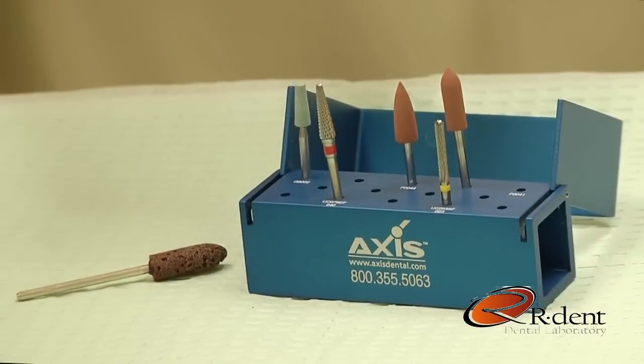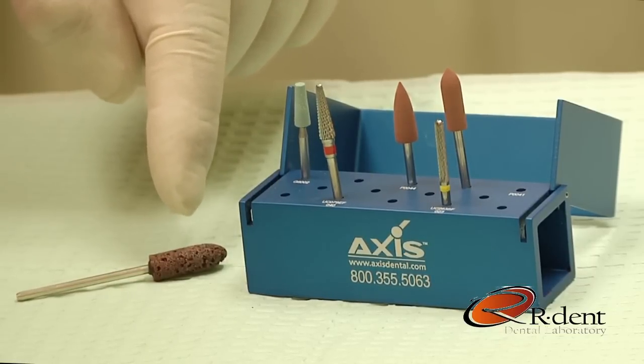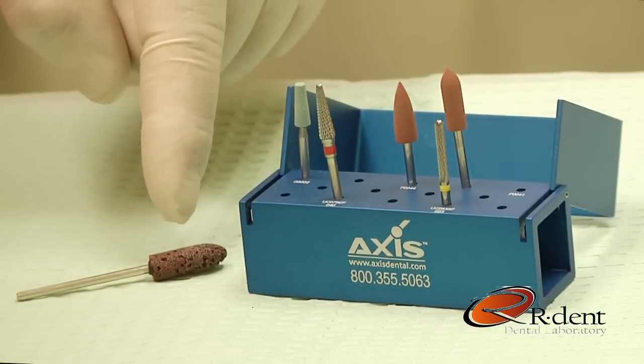Tips and a technique to properly adjust Valplast partials. To make these adjustments, we will be using a Valplast adjustment kit from Axis Dental Products. This kit consists of a fine and a superfine NTI Universal Cutter, 2 NTI brown silicone polishers, and a ceramic Supermax mounted greenstone. We will also be using a Valplast bullet-shaped trimmer, which is not included in the kit, but will be provided complimentary with your first case from Ardent.